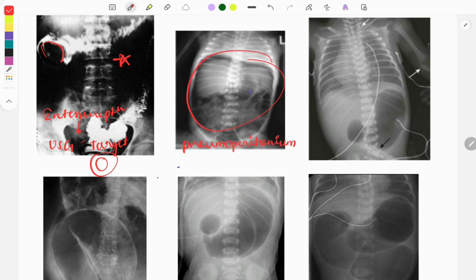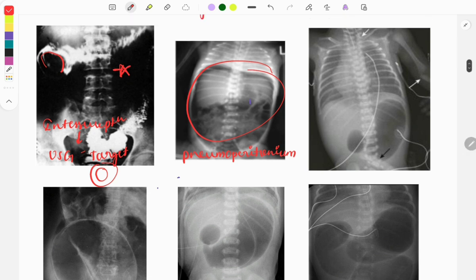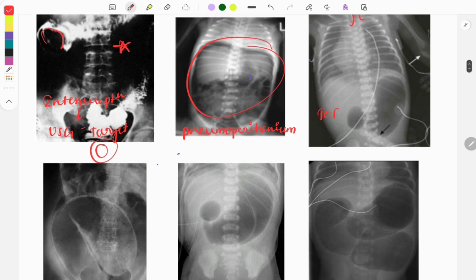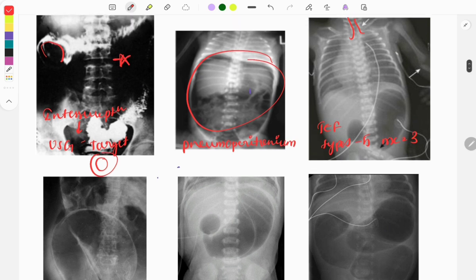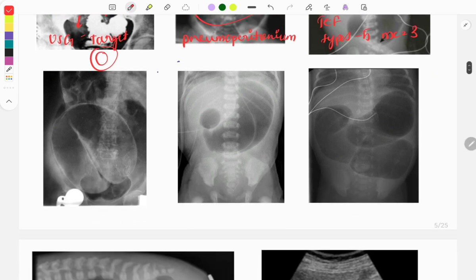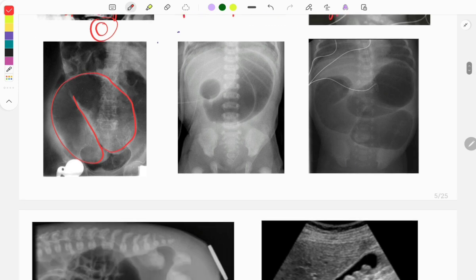The football sign — the abdomen of a child looks like a football filled with air. In the next image you can see coiling of the NG tube, a finding seen in tracheoesophageal fistula (TEF). There are five types of TEF and the most common is type 3. The next image shows a classical coffee bean sign, suggestive of sigmoid volvulus.